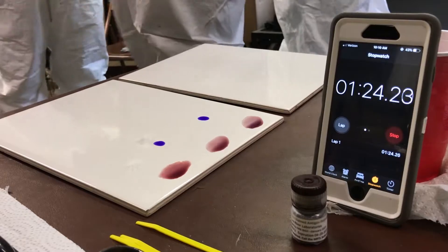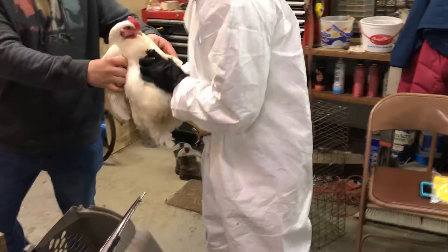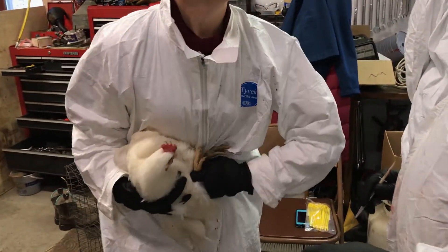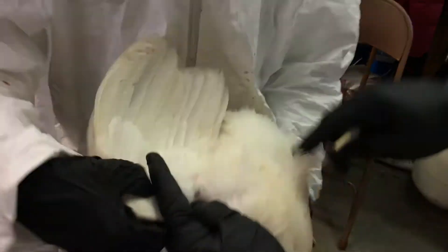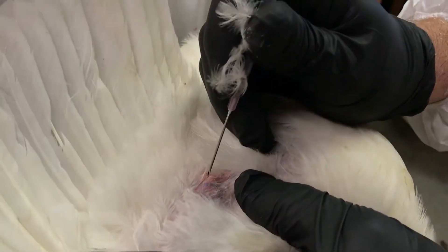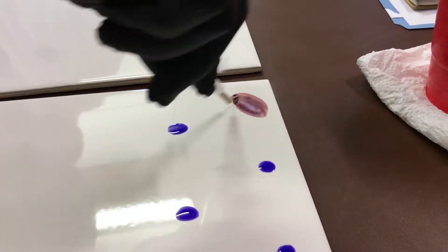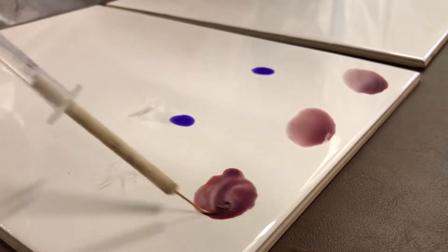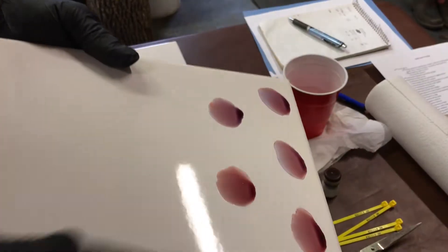When you are ready to begin testing, place one drop of antigen on the plate, timing it so the antigen does not have time to dry. With the assistance of your helper, position the bird on its side and pluck the feathers on the underside of the wing to reveal the brachial or wing vein. Puncture the wing vein with a sharp needle to obtain some blood. A 20-gauge needle is recommended for most birds. Using your loop, transfer a bulging loopful of blood to the drop of antigen. Mix the blood and the antigen thoroughly with the loop. The antigen and blood mixture should be about the size of a quarter. Rotate the plate and start the timer.